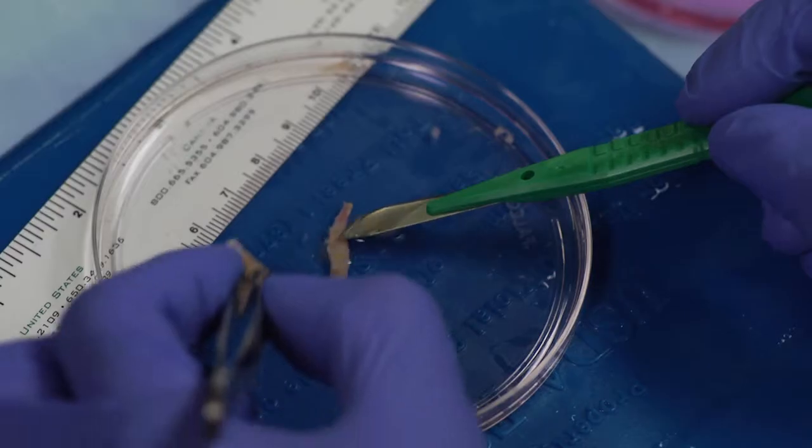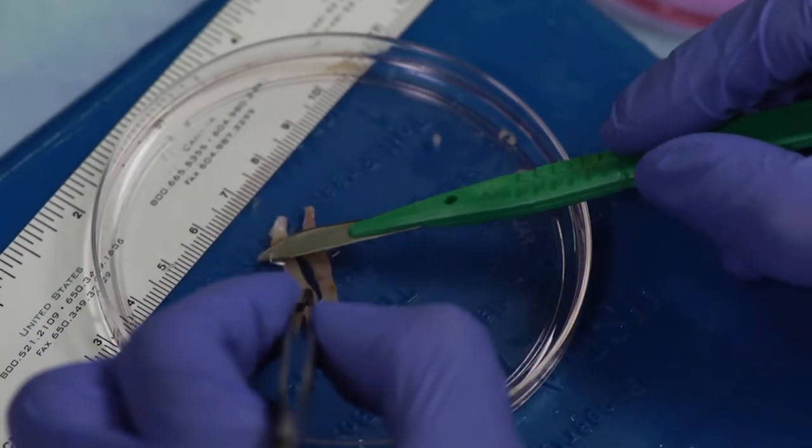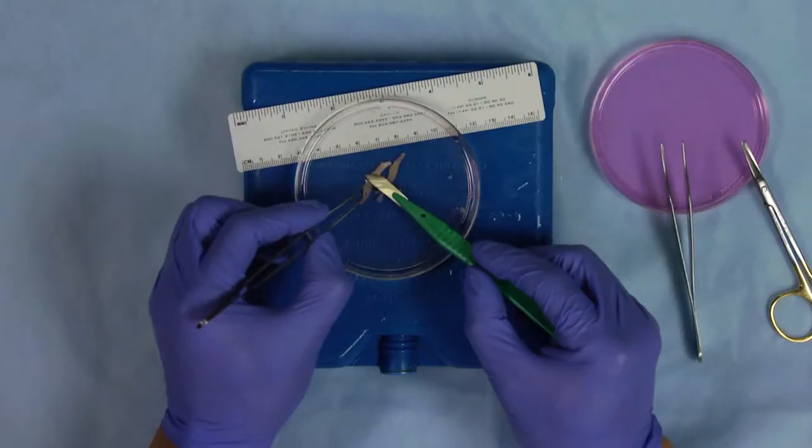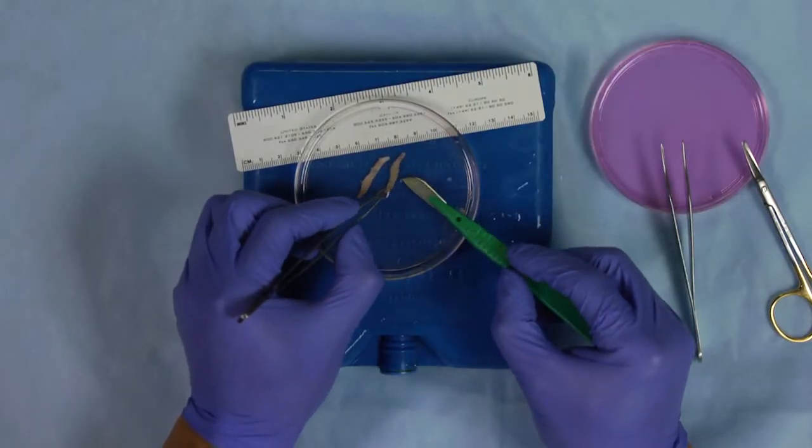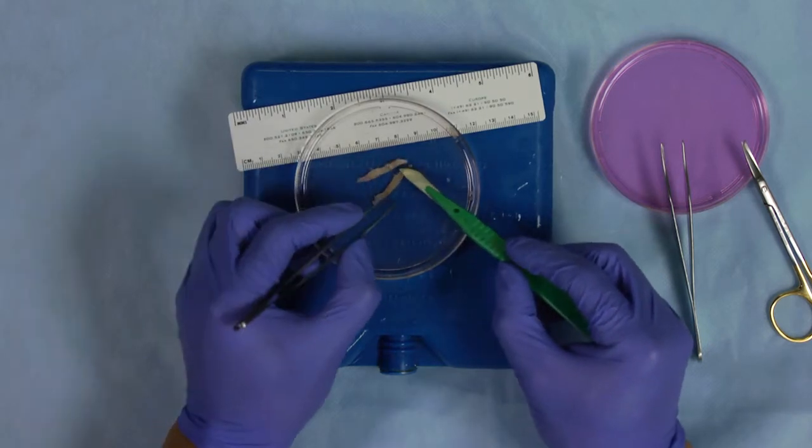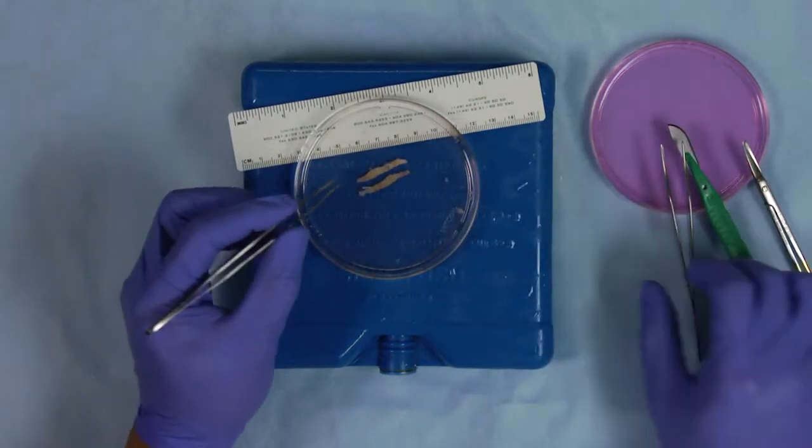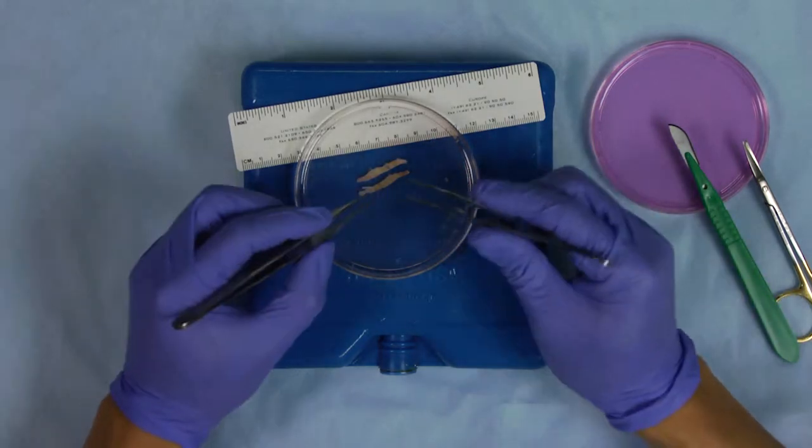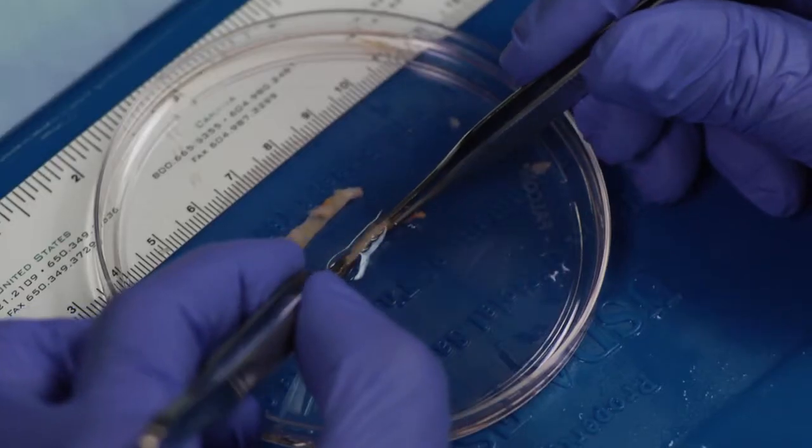Ultimately, the thickness of the cortical tissue should be about one millimeter. The strips should be about two centimeters long by half a centimeter wide. If there are pieces that are smaller, put them aside as they are good pieces to allocate to the 20% research portion of the study if the patient is participating.